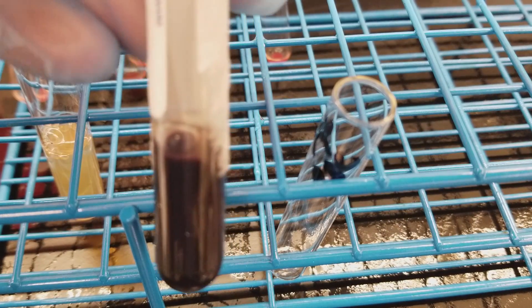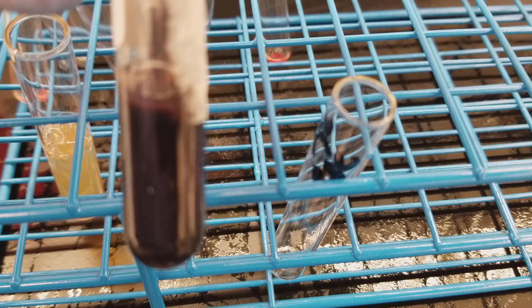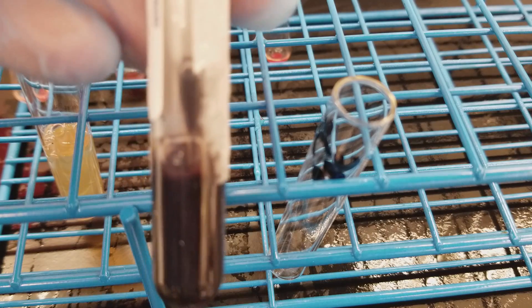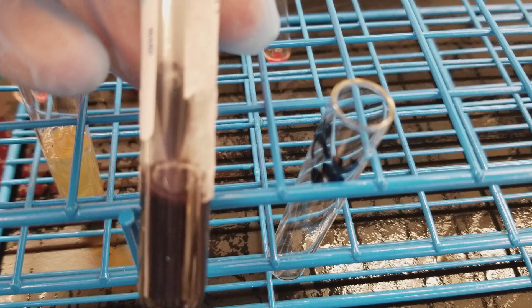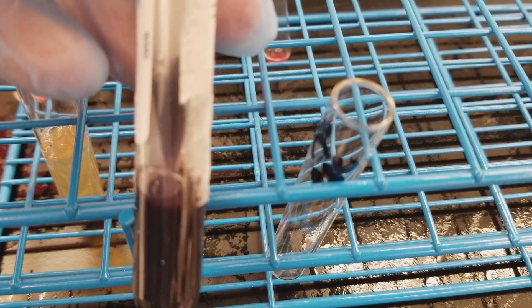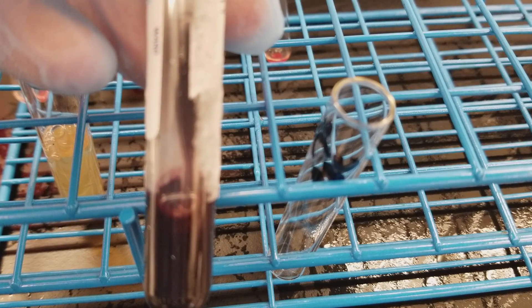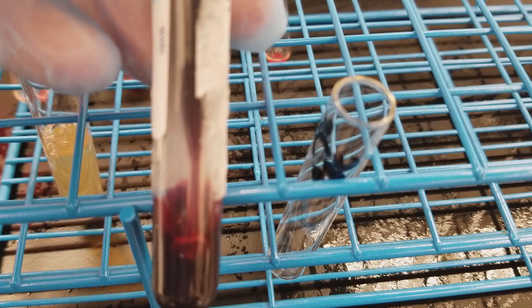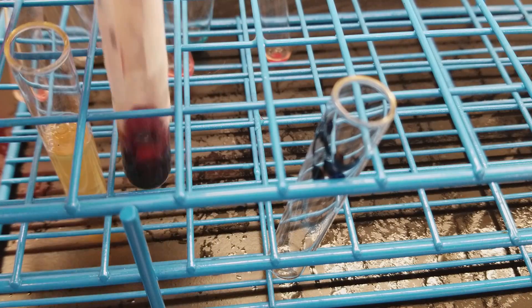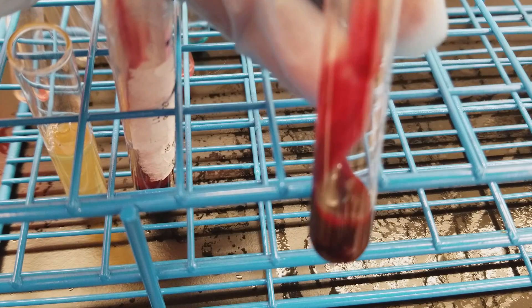I'm going to go all the way down to the bottom. You want to make sure you don't go all the way to the bottom so that it doesn't pull up into your transfer pipette. When you go all the way down to the bottom, you want to make sure that you first have your bulb of your pipette squeezed. So I'm putting those red cells into the tube.